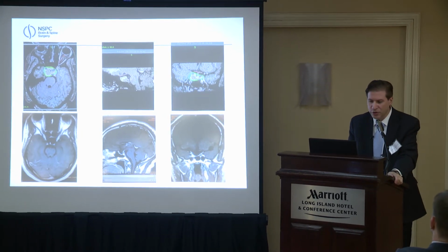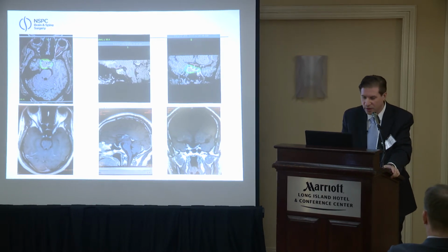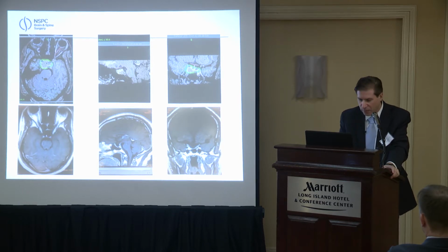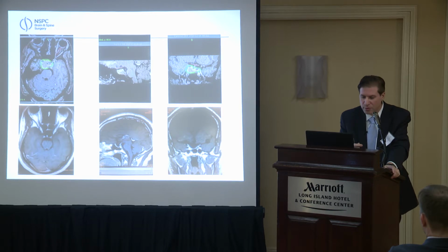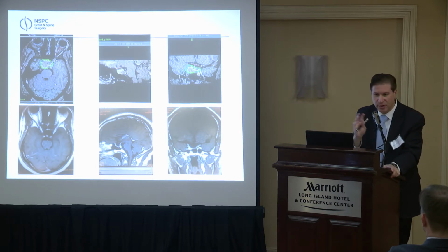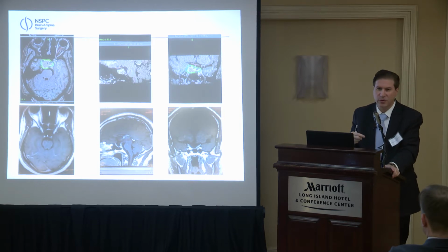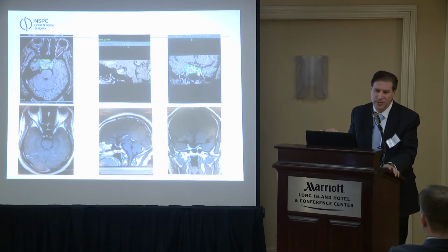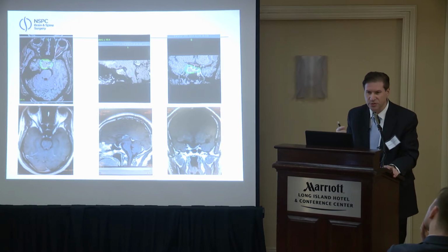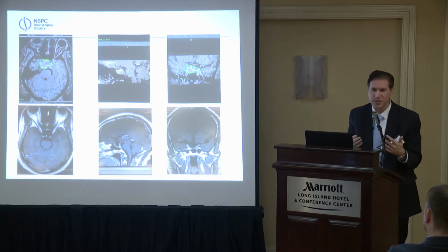When it's acromegaly or Cushing's, usually the feeling is we should do transsphenoidal surgery, and we usually do endoscopic transsphenoidal through the nostrils because there's a chance of curing them at surgery, and I think the transsphenoidal is a very low-risk brain operation. However, for those patients with acromegaly or Cushing's that you've operated on and you couldn't get all of it out, radiosurgery is a very nice way to go. You tend to give a higher dose than if it was a non-secretory tumor. For the non-secretory tumors, if they're big, causing optic nerve compression symptoms, we'll often operate first. But again, radiosurgery is nice for recurrences or residuals, and it's also good if the tumor is not really pressing much on the chiasm or if the person has medical problems.